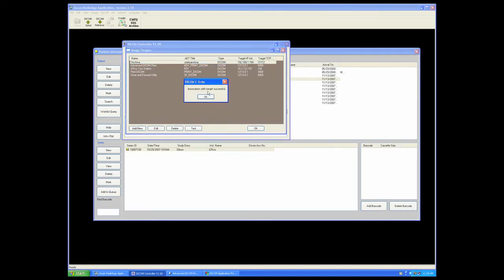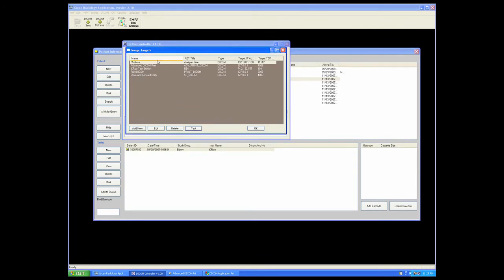When you receive this notification, association with target successful, we have completed a successful network to the particular target. You may list as many targets in this window as is necessary.